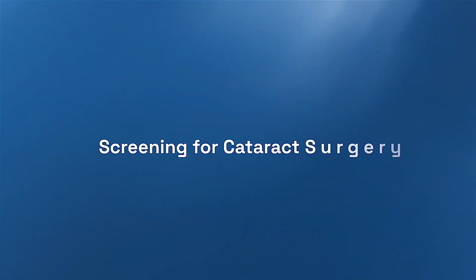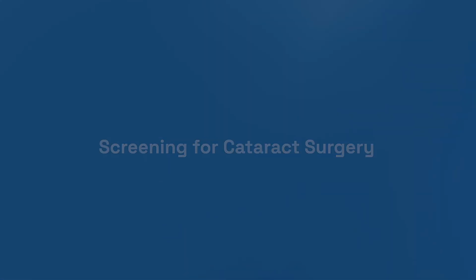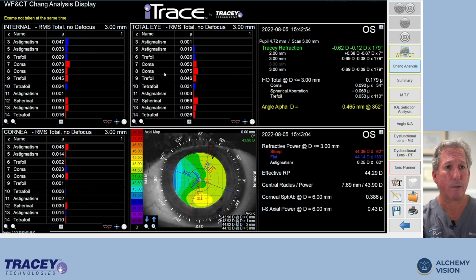So we talked a little bit about different types of things we have to screen for when we're doing cataract surgery. And one of those things is also looking at the ocular surface for symmetry or uniformity. And one thing that can really affect cataract surgery is dry eyes. And so in this patient, what you can see is some inferior steepening, and typically this is caused by the fact that the tear meniscus is low in these patients with dry eye, and so they tend to get punctate keratopathy more prominent in the inferior cornea, and that will actually demonstrate itself as highlighting steepening of the cornea.